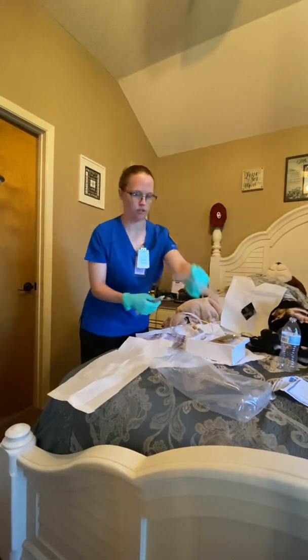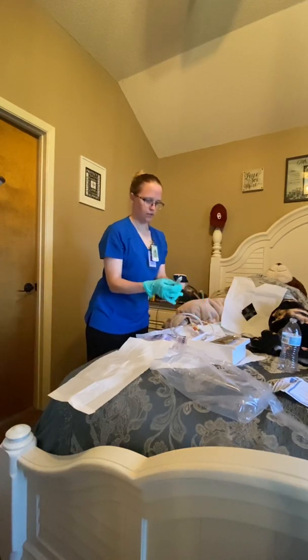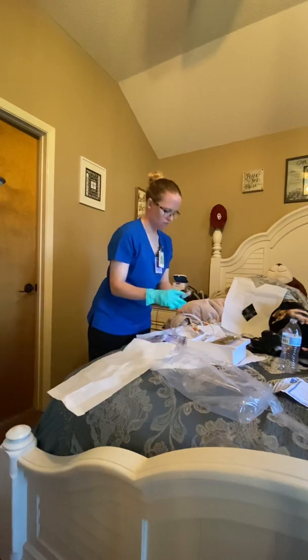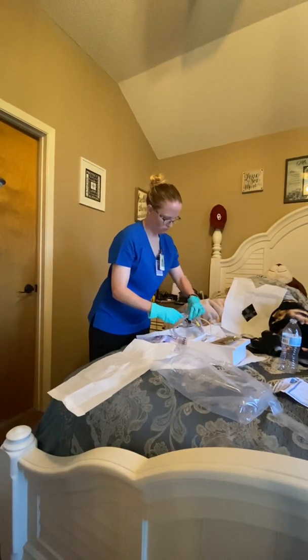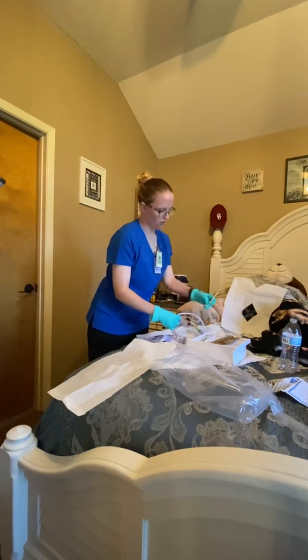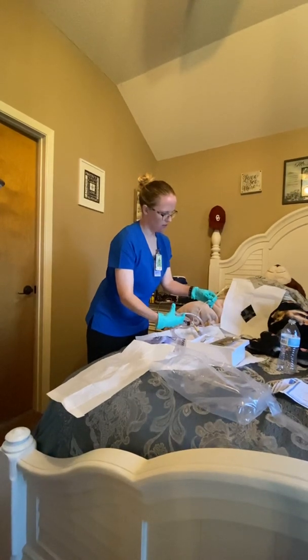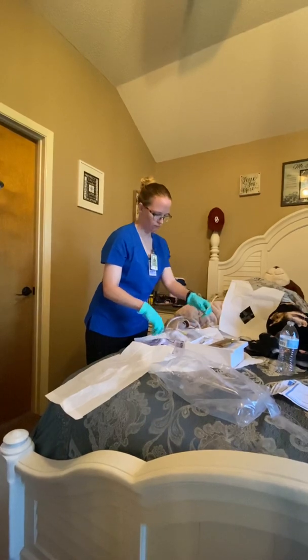I'm going to trash this. Make sure that's a trash can. Next, we're going to take off the lid of our syringe. Put it in the trash can. Going to attach it. We're going to check to make sure that the balloon inflates. And it does, so now we're going to retract it. Just making sure that there's no holes in the balloon.